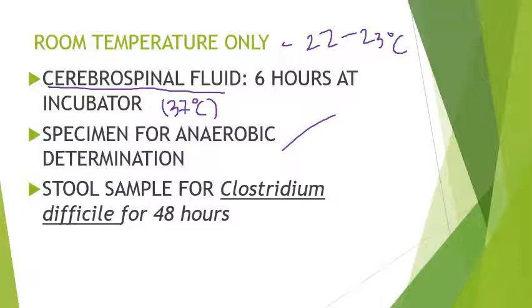Another thing, for the anaerobic determination, if it is abscesses, pus or abscesses, since it is an anaerobic determination specimen, it can be kept at room temperature.